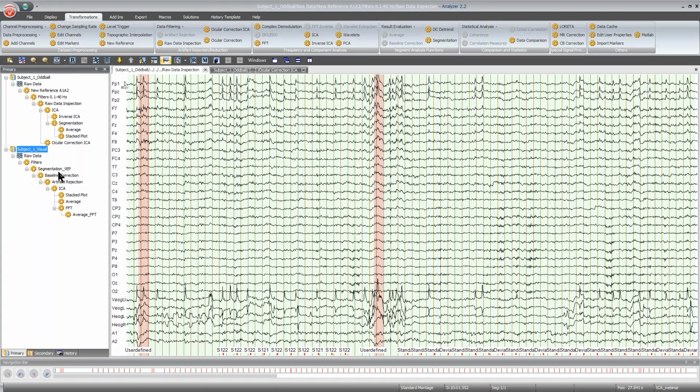As this question sounds, it means like upsampling the data to get more data points in a short period of time. I would actually not do this because upsampling the data means not adding information. So this is just interpolation. So I would not just sample up the data. However, of course, if you sample during recording already with a very high sampling rate, then this might already fulfill, of course, the prerequisite for ICA, because then you have more data points for a short stretch of data.